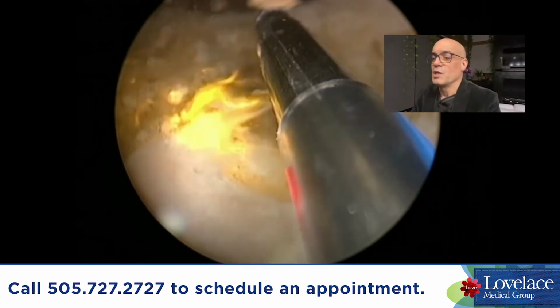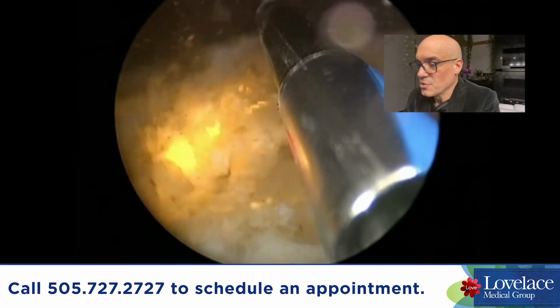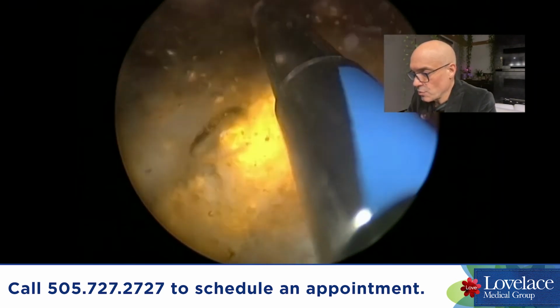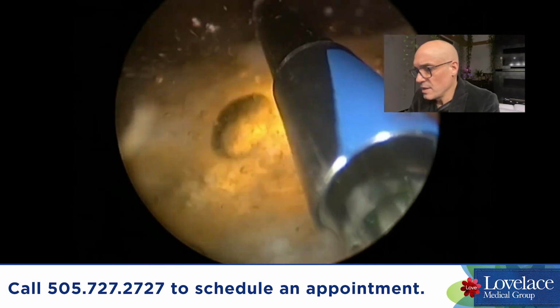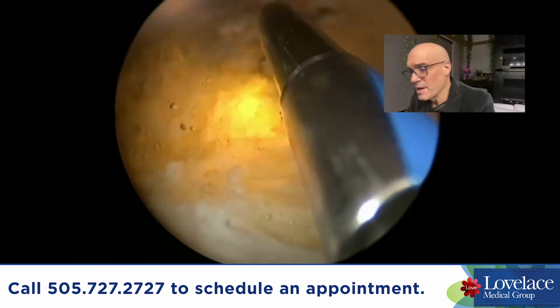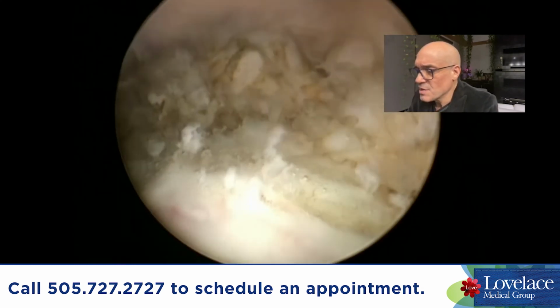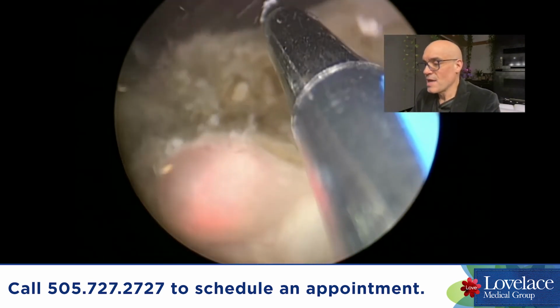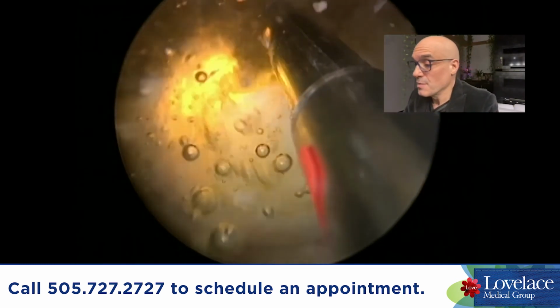So this is a video of the GreenLight laser in action. It's a transurethral procedure. It's done under general sedation in the operating room. It generally can take anywhere between 30 to 45 minutes up to about an hour and a half. As you can see, this is done through what we call a cystoscope into the prostatic urethra, so it's in the reverse direction, the way the urine comes out.